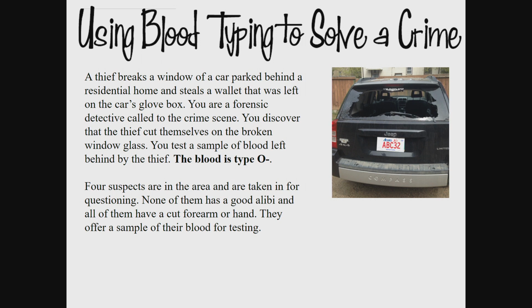Using blood typing to solve a crime. A thief breaks a window of a car parked behind a residential home and steals a wallet that was left on the car's glove box. You are a forensic detective called to the crime scene.